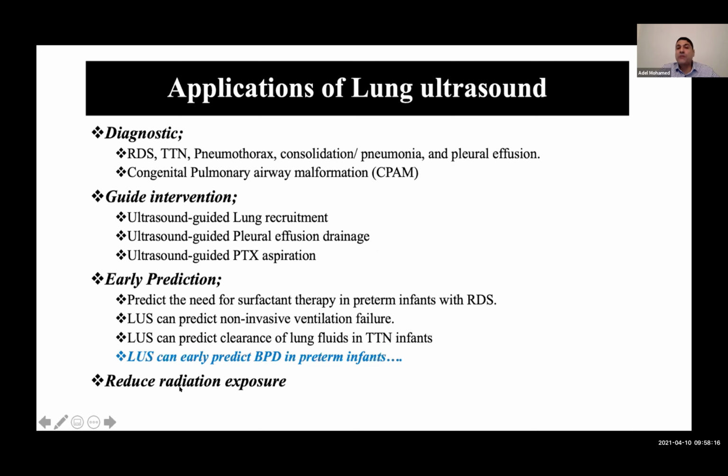Definitely, and think of this one, I'm not here talking about replacing all the X-rays with lung ultrasound. We are not there yet. It needs manpower, you need people who are experts, you need to be around all the time in the unit. It's not impossible, but at least reduce your baby from being exposed to lots of unnecessary X-rays, especially if you have a tool that will not give you less information than the X-ray. On most occasions, it will give you more and more information about what's going on in the lung of your patient.